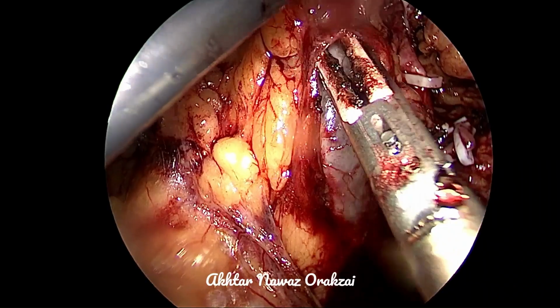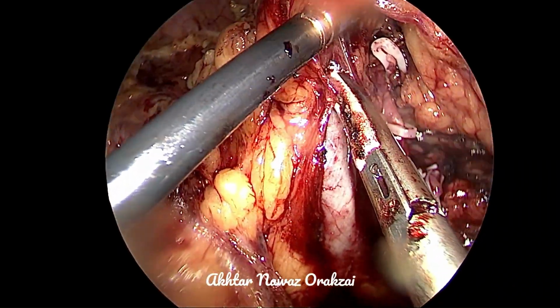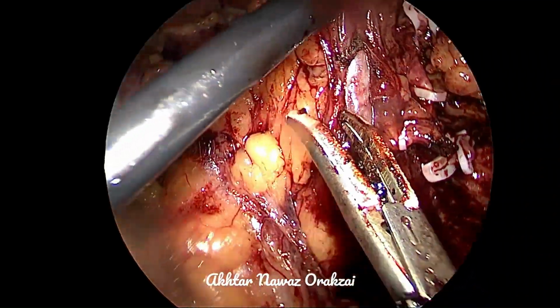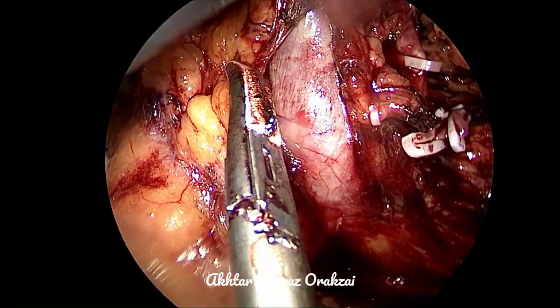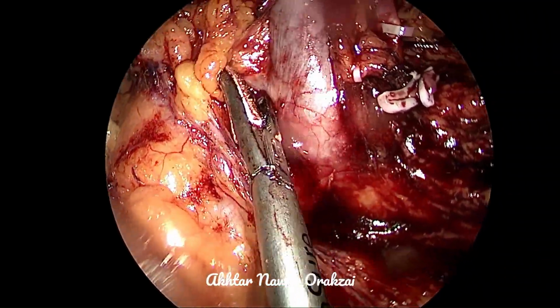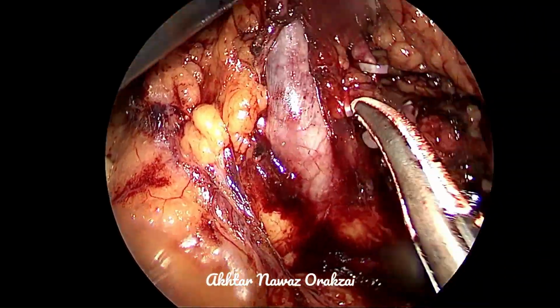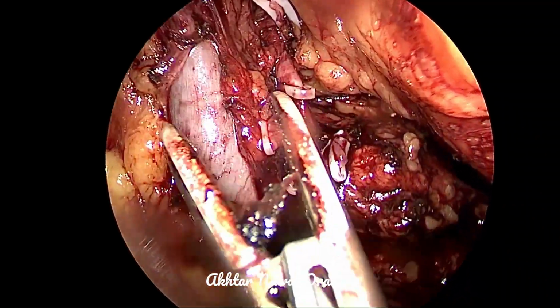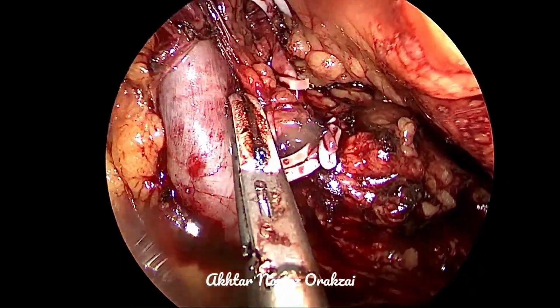However, it is important to know whether there is another artery or not, or there is a branch of the other artery or not. What I felt was that there is a big artery which has divided into two. Since we are working close to the kidney, that's why we have ligated one branch, but the other branch will be there.